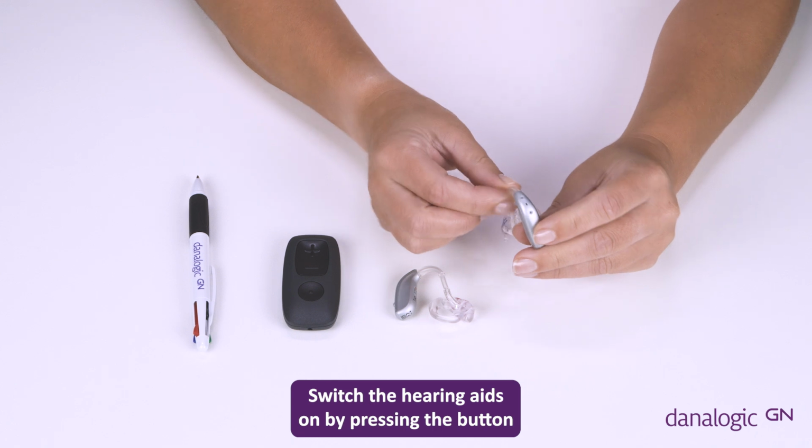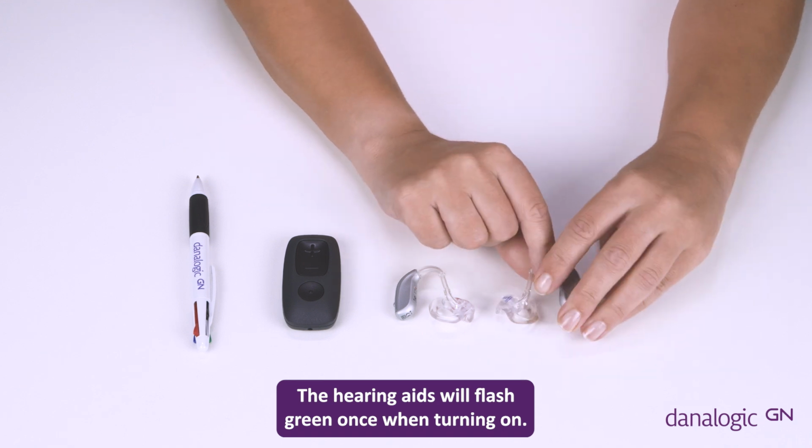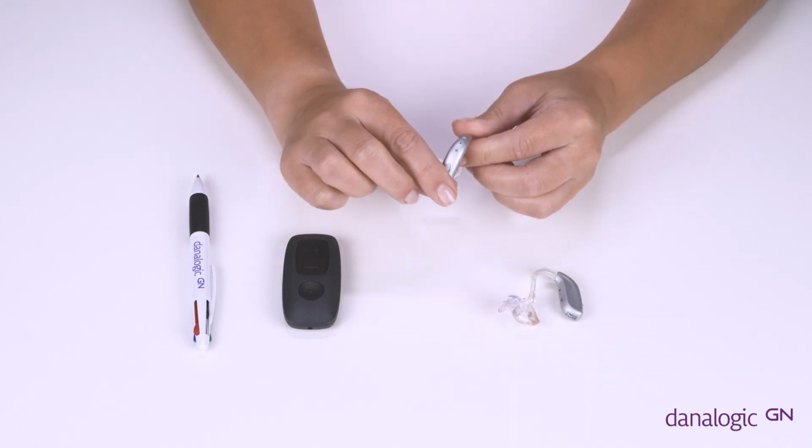Switch the hearing aids on by pressing the button on the back of the hearing aids for 5 seconds. The hearing aids will flash green once when turning on.